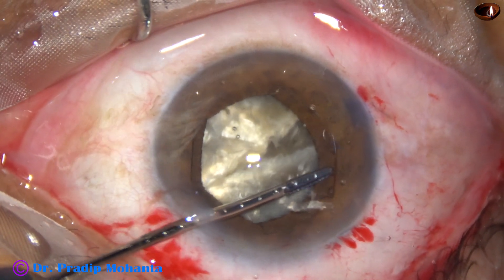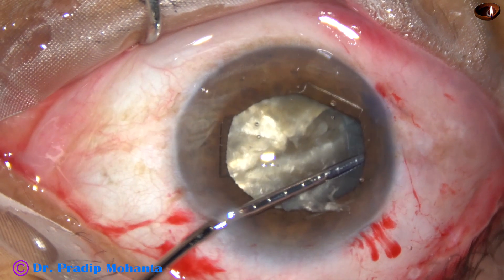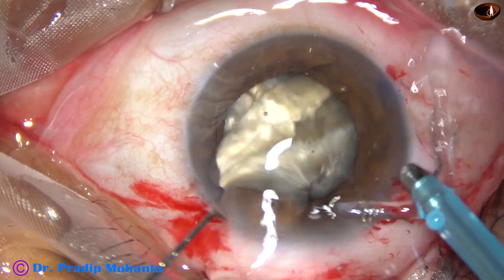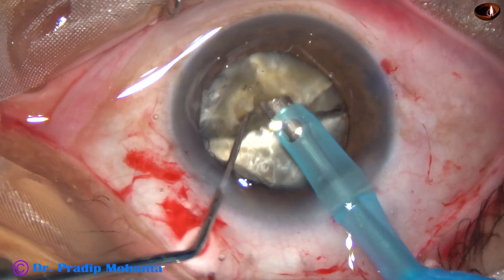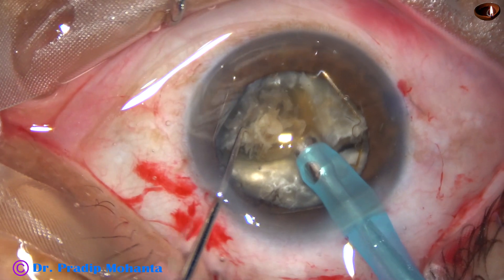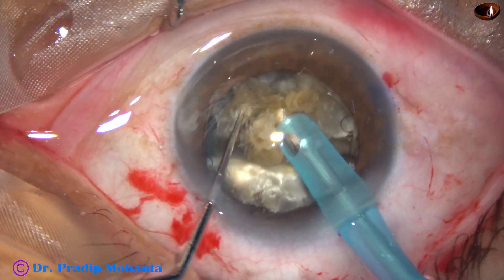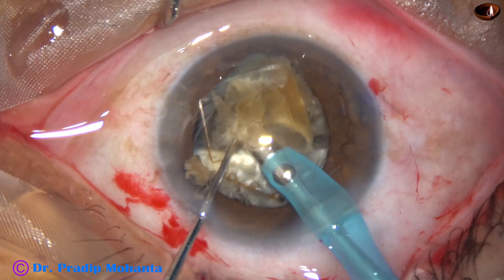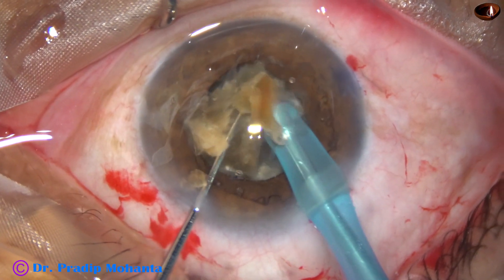Alternate flanges are tucked by these B-Hex forceps. Let's see what has happened in this case. As I go in with irrigation, the pupil dilates — probably because of LIRS: Lens Iris Diaphragm Retropulsion. And the B-Hex has come out. The flanges which were tucked have come out, and the B-Hex is now in the anterior chamber.